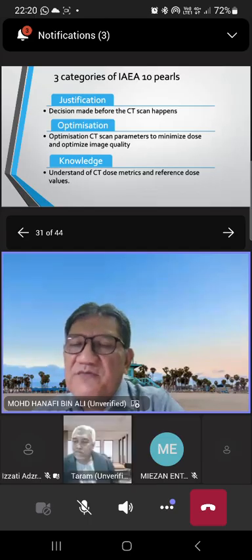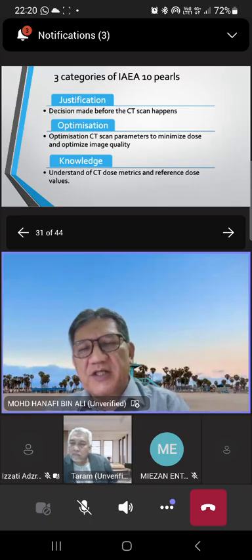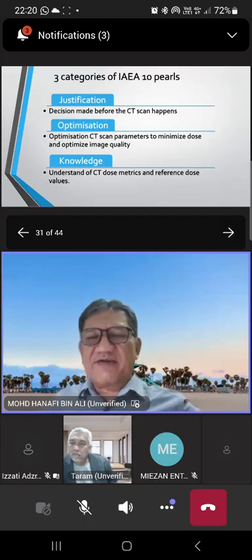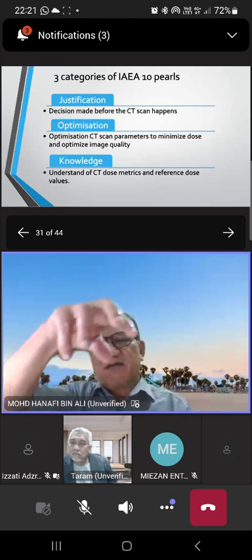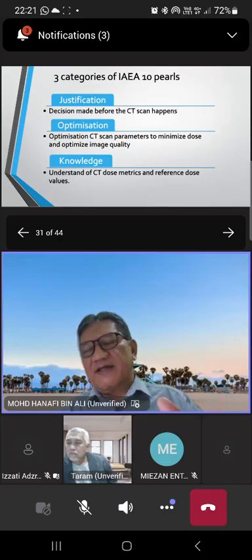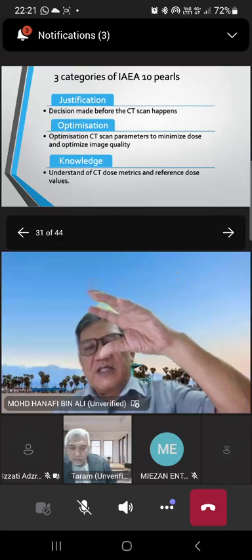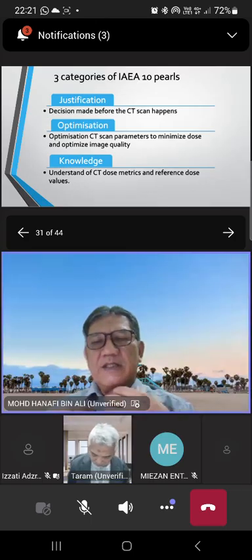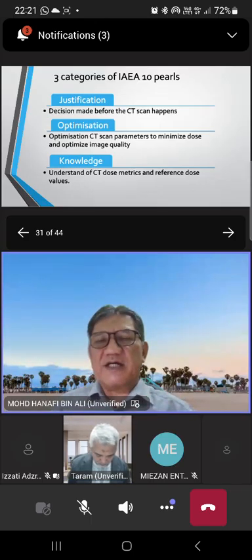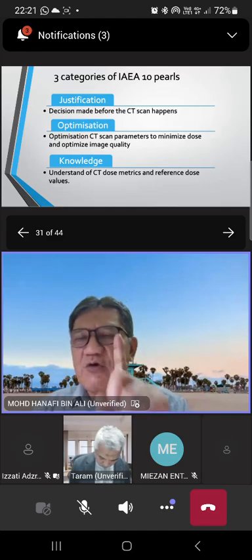Okay. There are a number of factors. Like I said, we now have automatic control of exposure factors. For smaller structures, we reduce the exposure. Like AP and lateral: AP is quite thin, lateral is a little bit thicker. So when the X-ray tube moves to one side laterally, they increase the exposure factor. When it moves around to the other part, they reduce the exposure factor. When it comes to the chest, the breast, they reduce the radiation. So with that, we optimize. Yes, the term is optimized.